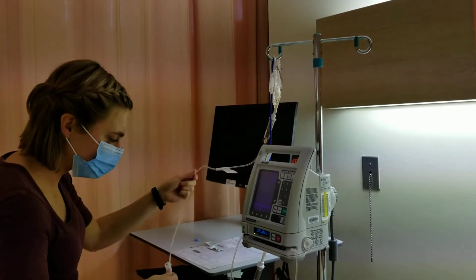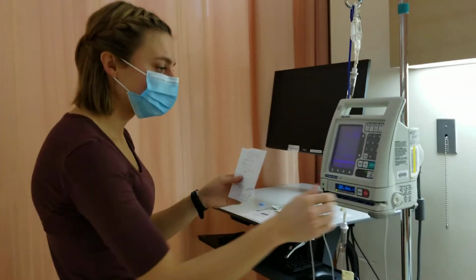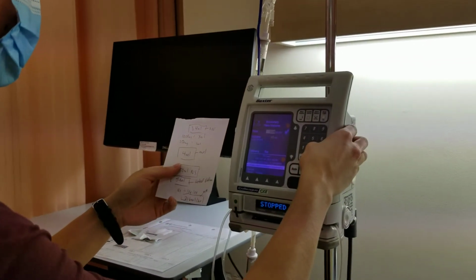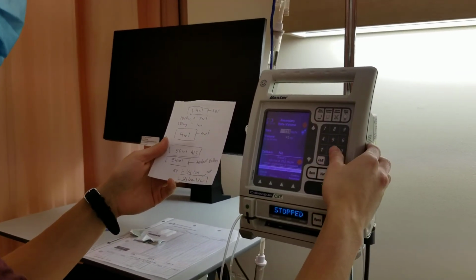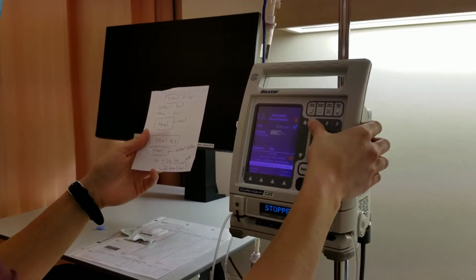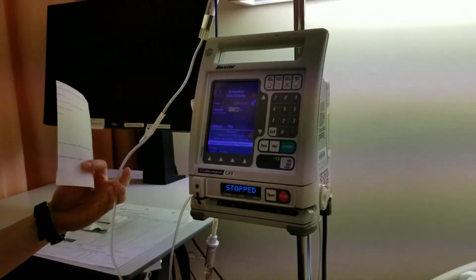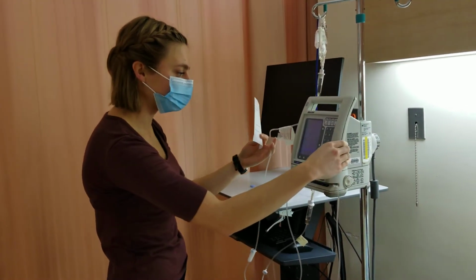My clamp is closed, so I'm ready to set the rate on the secondary. So I'm going to hit stop primary. I'm going to hit secondary. And I'm going to program 216 per hour, and the volume is 54 mils. And that's good. So I go confirm secondary. And I'm going to open up my clamp here and hit start.